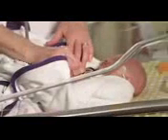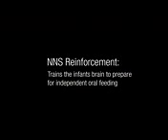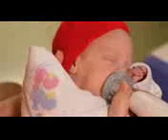All infants develop their non-nutritive suck response late in a full-term pregnancy. Preemies are denied that developmental period because they're born early. And in a NICU, there are so many distractions in their environment with noise, sound, touching, feeding tubes on their face and oxygen tubes on their face, that this interferes with neural development in the suck central pattern generator. Because of this interference, preemies often don't develop a healthy non-nutritive suck response.